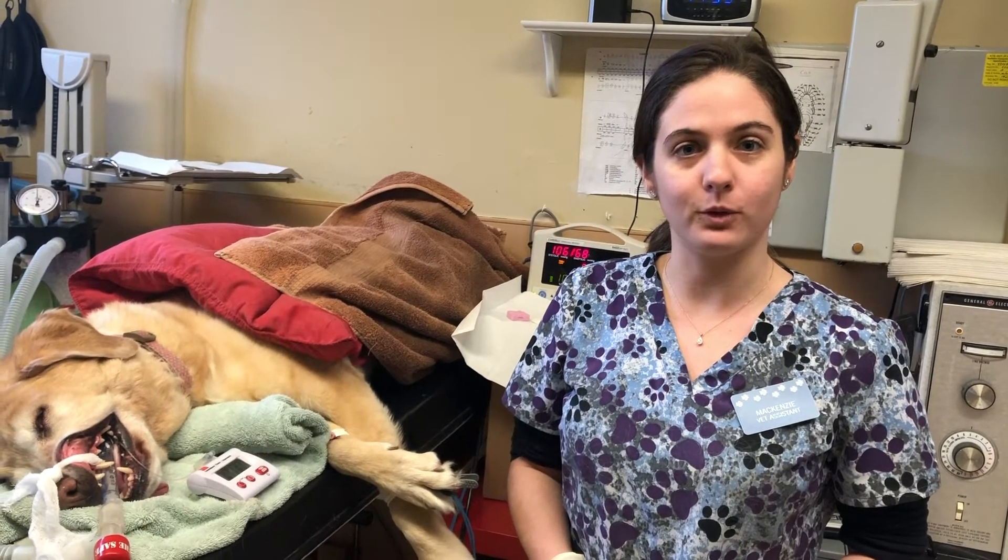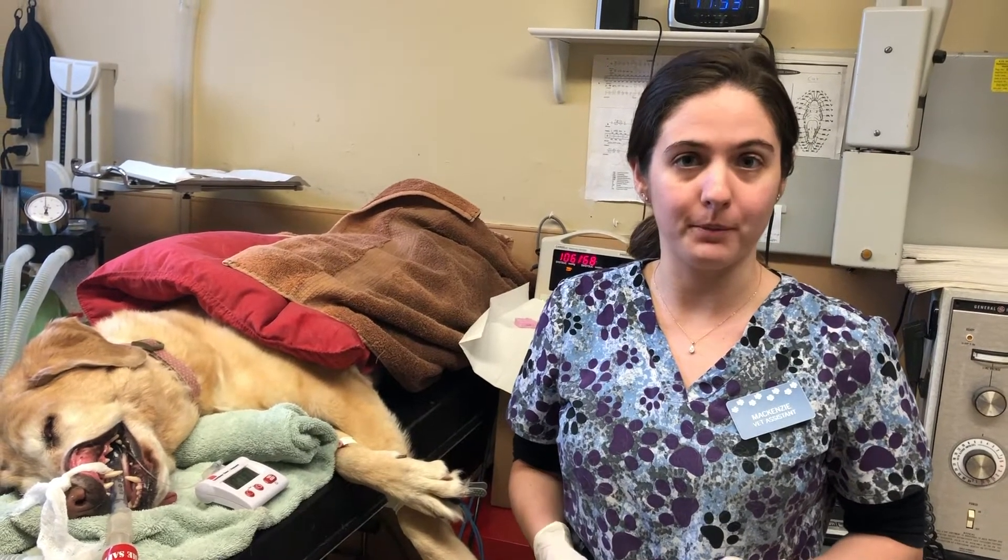My name is Mackenzie Meldrum. My student ID is 3254433. In this video, I'm going to demonstrate how to perform a buccal mucosal bleeding time test.